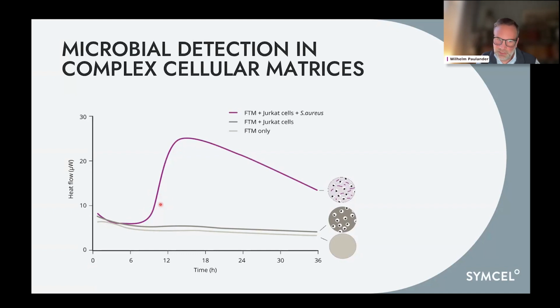This is significant for all the microorganisms that we looked at. The height of the metabolic activity, of course, varies. You saw it was lower for Micrococcus. It can look different for E. coli, where you can have several peaks, aerobic and fermentive peaks, or as in this case for Staph aureus, you have one major peak that continues for a very long time, where you have a sustained metabolic activity.